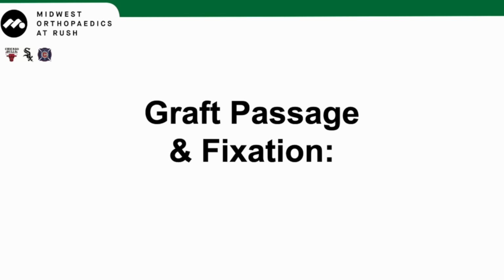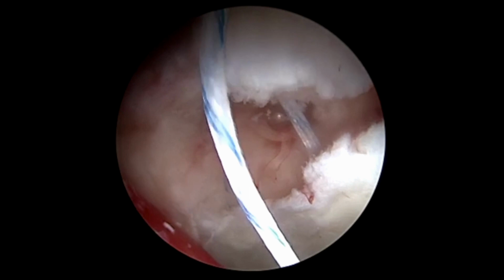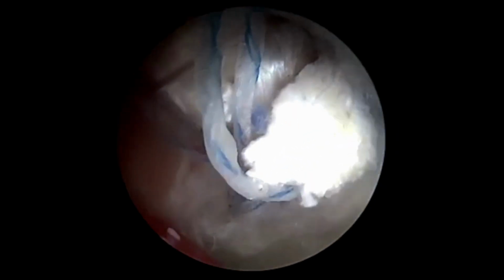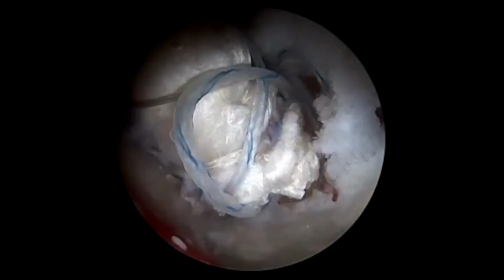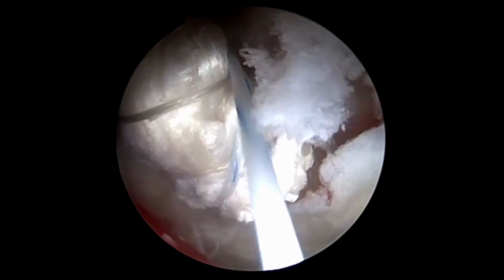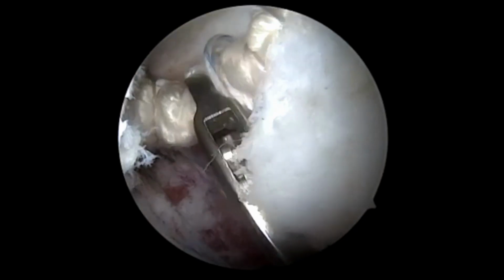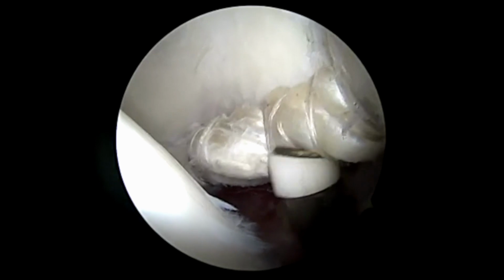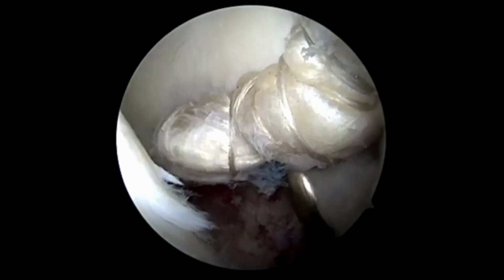With traction resumed, the graft is then placed through the distal anterolateral accessory portal and cannula using the kite technique as previously described by Bhatia and colleagues, and the graft is then positioned into place using the medial and lateralmost anchors as two guide wires to pull the ends of the graft into place until it comes adjacent to the intact native labrum. The posterolateral anchor is secured and tied using arthroscopic knots.